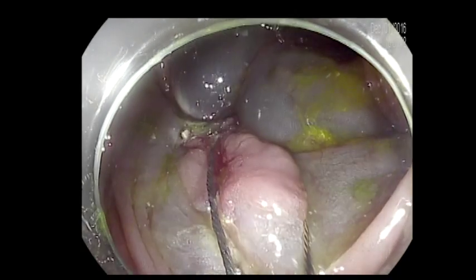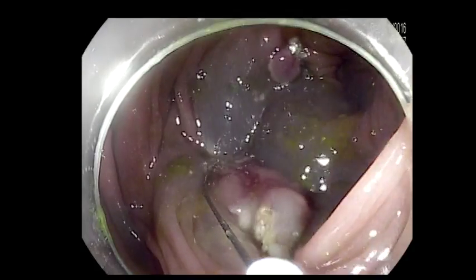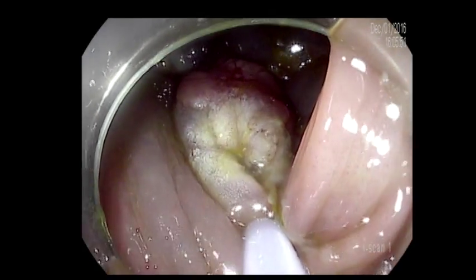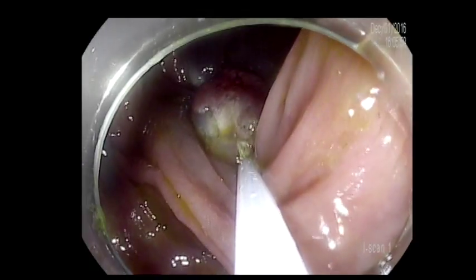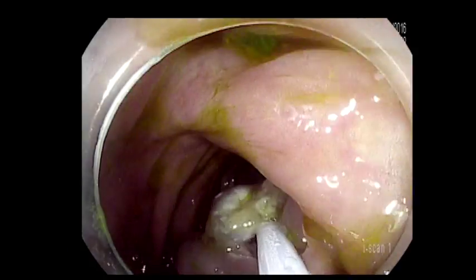So that's our third piece. Now we're focusing to get everything together in one piece, and we're also focusing on getting some clear margin — some of the normal healthy tissue — to ensure clear margin of the polypectomy. It looks like finally we got a good grasp of the lesion, and we're removing most of it in this third piece.